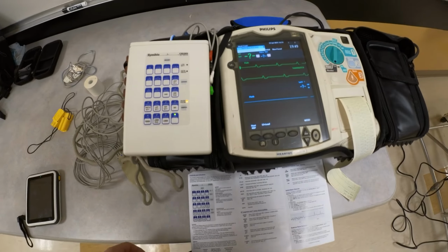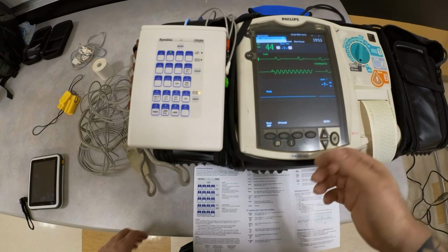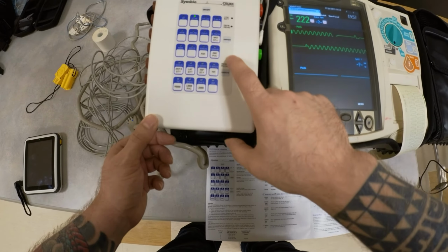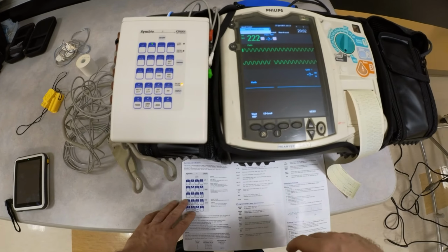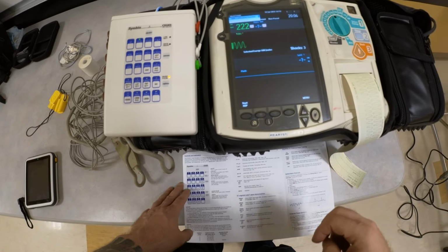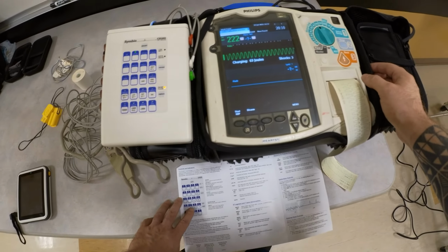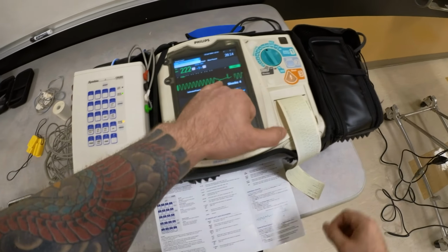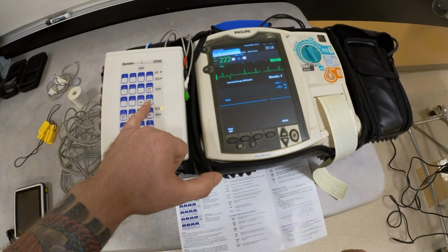So let's say for the initial one, we had ventricular tachycardia and students were performing synchronized cardioversion. So what I could do is say we're going to convert to sinus rhythm, and then they would want to do a 12 lead EKG. So students will synchronize. They will charge. Everyone's clear. They delivered the shock, right? You see that conversion. It goes to sinus rhythm.